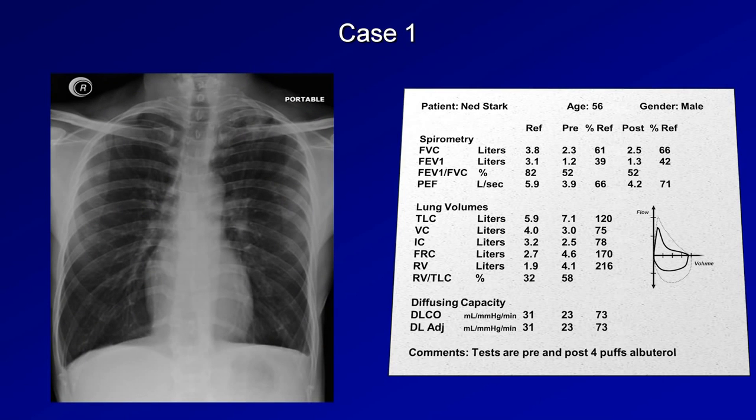You may want to pause the video here to assess the data yourself and attempt to come up with both a general category of lung disease this patient likely has based on the PFTs, as well as a most likely diagnosis, which incorporates the history, exam, and chest X-ray.